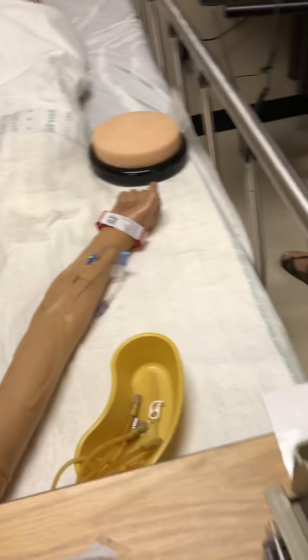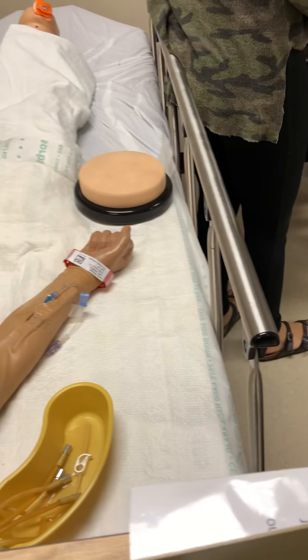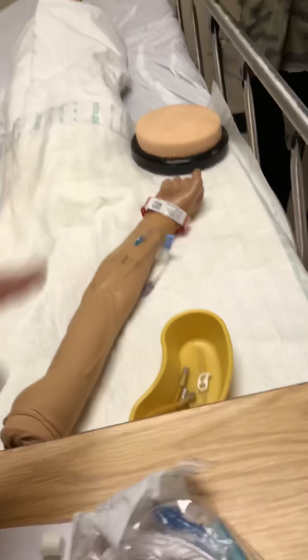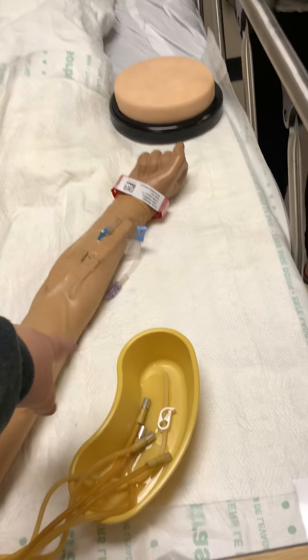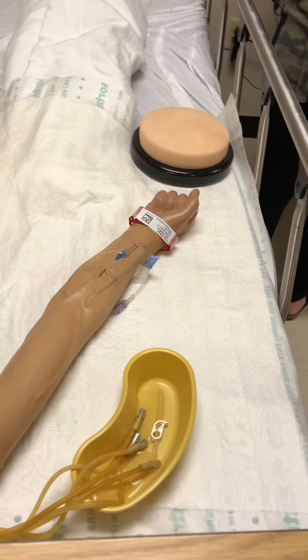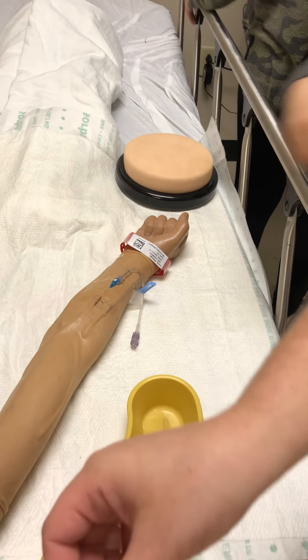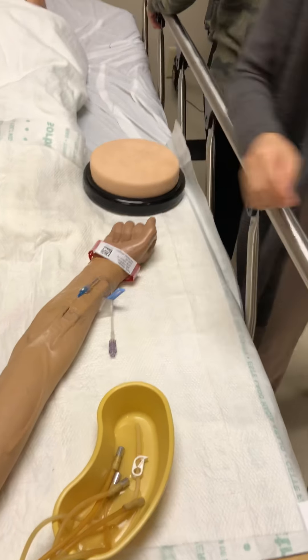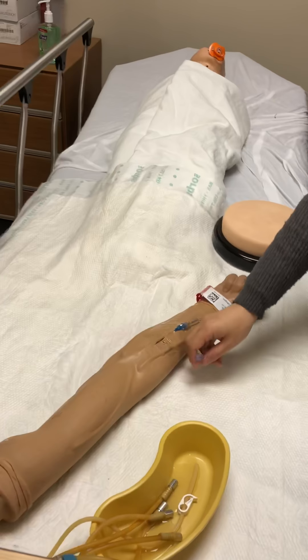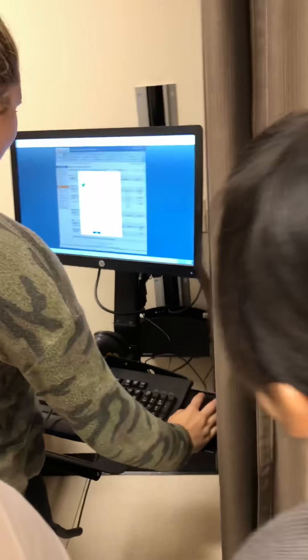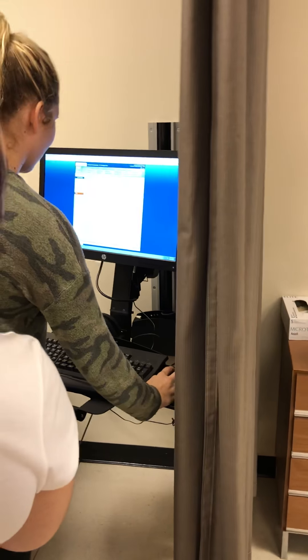So then we just record administer time. Do we have to put that in? This end stays open? Do we have to keep it clean? In the hospital we have a cap — we can put the cap here too. But for check-off purposes, we don't have to really worry about that. I'm going to just cap it. Or we can leave it like this, but we have to clean really well. Can I — should I not push save? No. You can't go back.